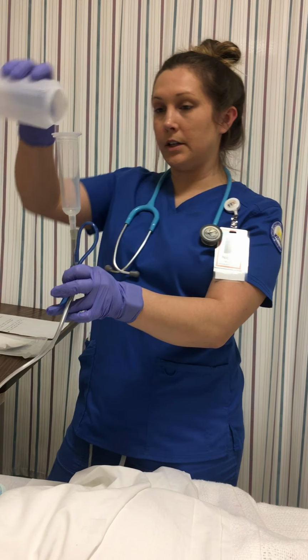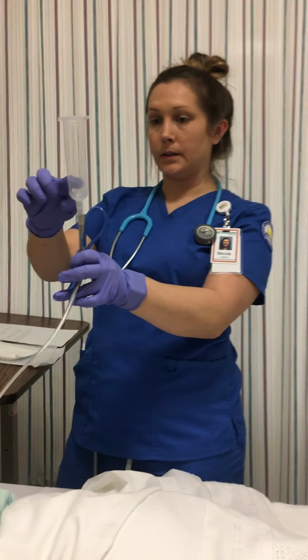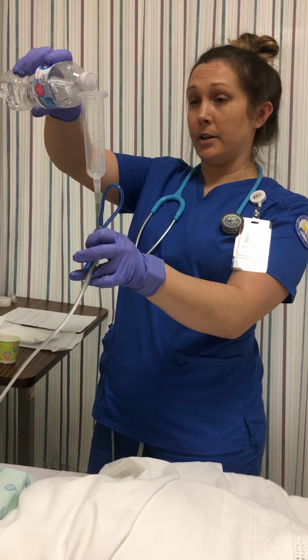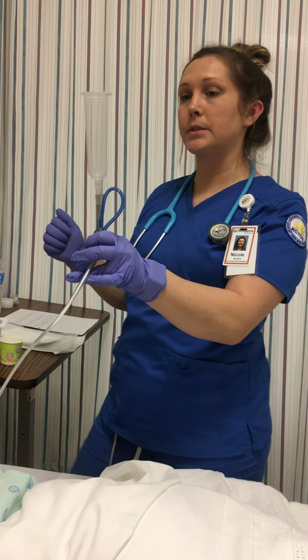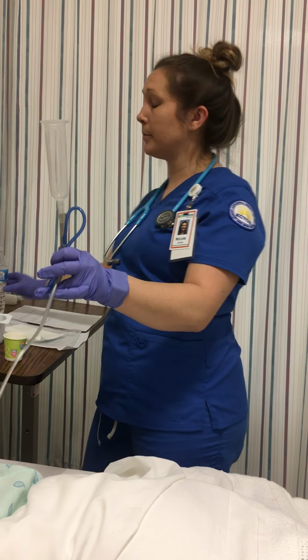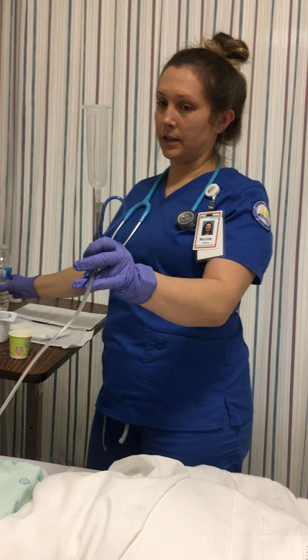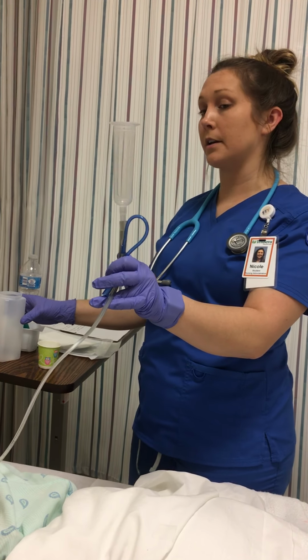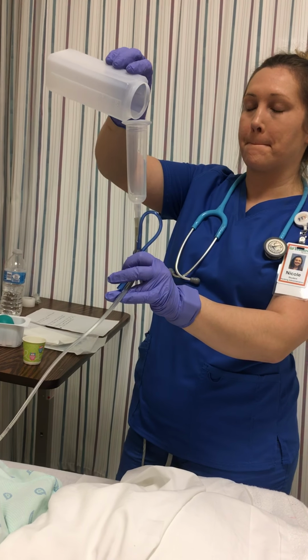and I'm going to put 50 mLs of water, and before the water line goes down, I'm going to start administering 50 mLs of my Glucerna, and that way I'm not letting any air bubbles get in. Once the 50 is down to the bottom line, I'm going to administer another 50. Same thing, not letting any air bubbles get in. I've now administered 100 milliliters of Glucerna, so I'm going to flush it again with 50 mLs of water.